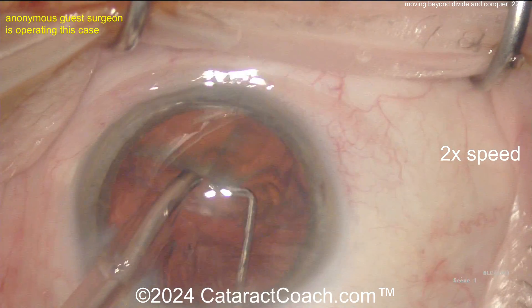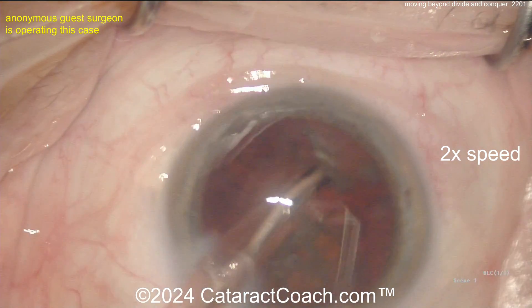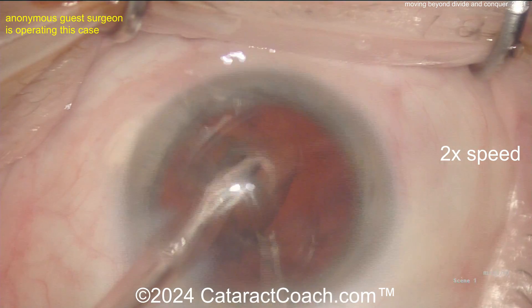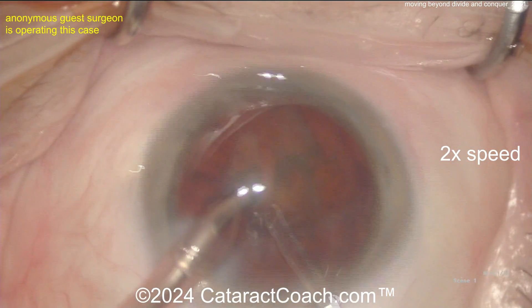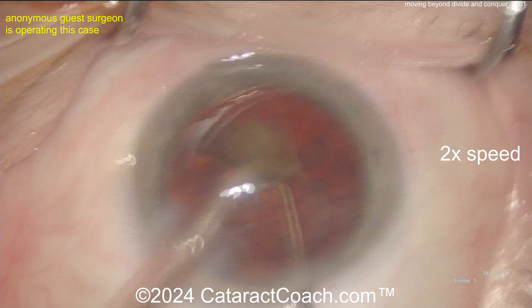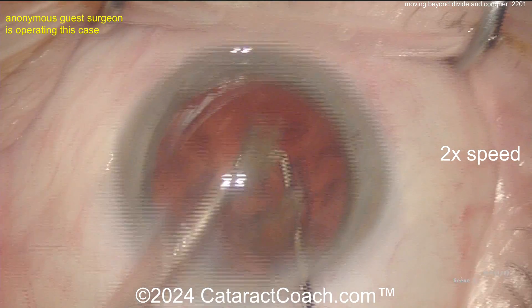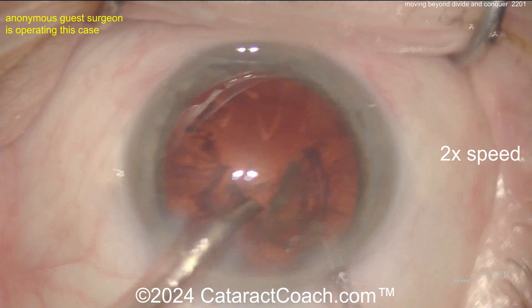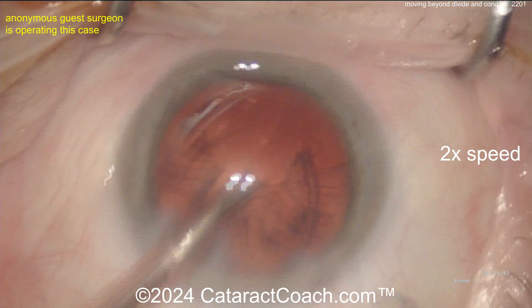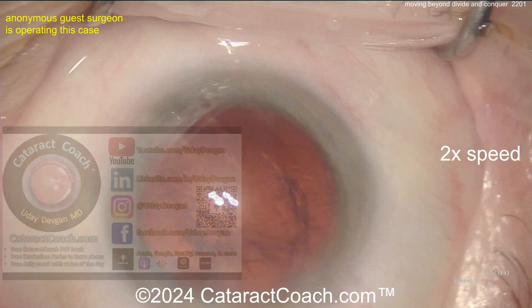Almost — vacuum — and kind of a chop. Here's the catch: you have a finite window of time to accomplish the chop, because as you buzz on the phaco probe you start to lose suction. It only keeps that high suction for a second or two. When you tried to put the chopper around the equator, what ended up happening is you pushed the piece off the tip of the phaco probe. I'm proud of you for trying the chop — that's great.